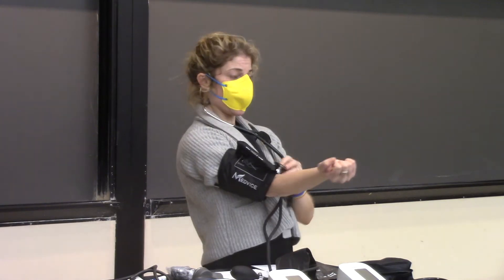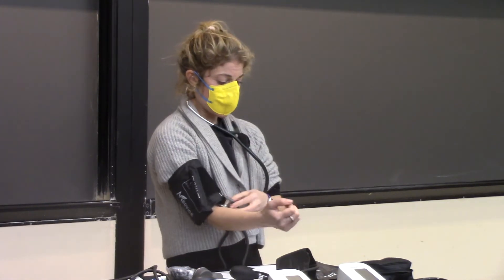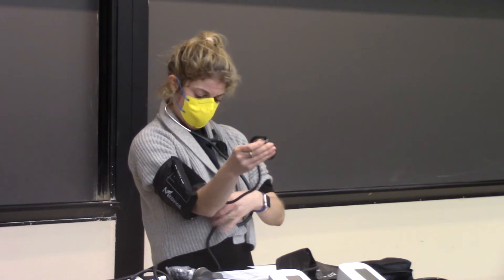Then you're going to practice pumping up the cuff. They look a lot easier to pump than they actually are. There's a valve here.